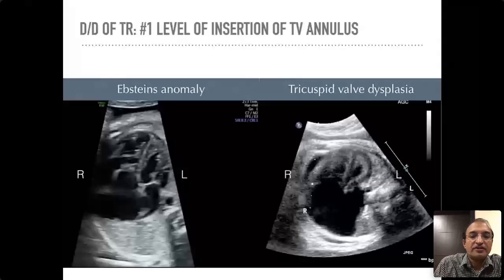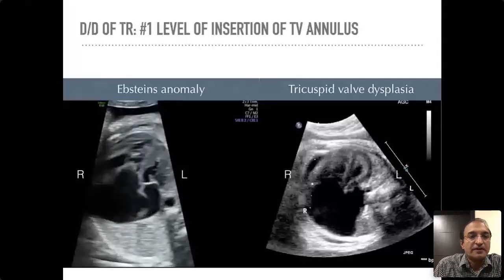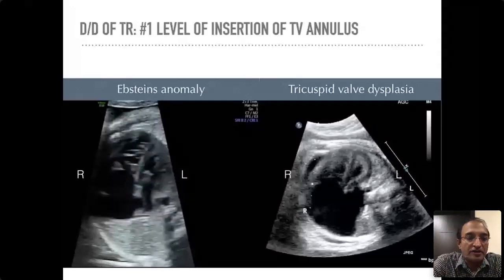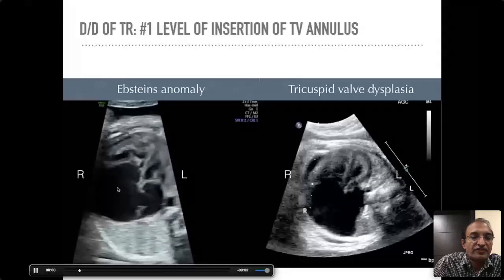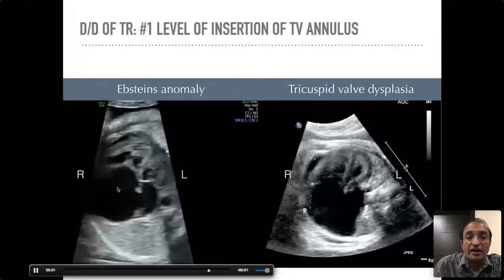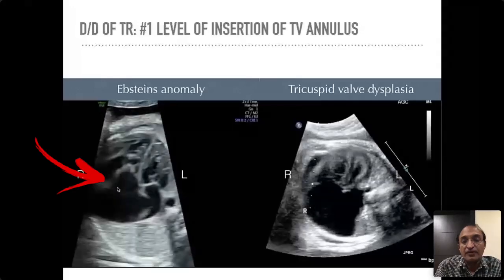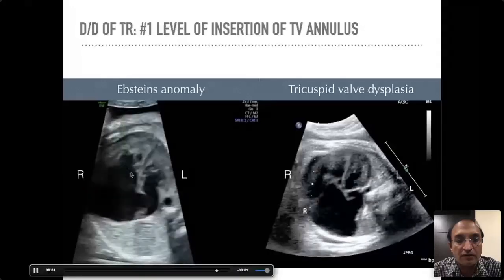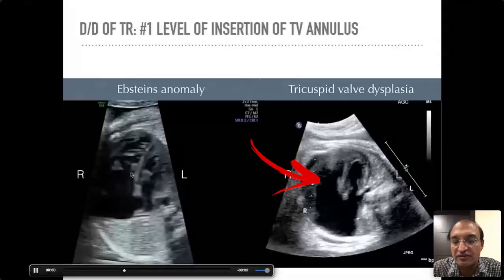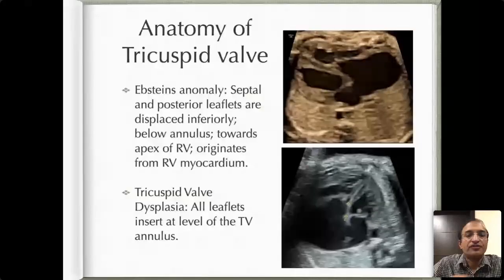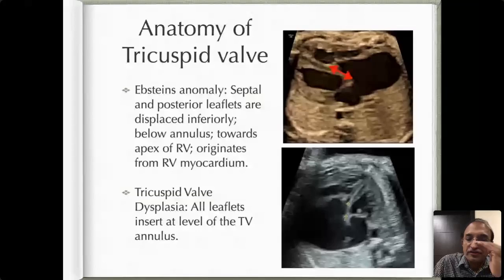Let's look at these pictures side by side. This movie is labeled as Ebstein's anomaly — note where the tricuspid valve is inserting. Right and left are marked so you can identify the right and left ventricles. In Ebstein's, the tricuspid valve inserts at a much lower level, displaced downwards. In tricuspid valve dysplasia, it stays at the normal insertion level. The hallmark of Ebstein's is downward displacement of the septal leaflet, whereas in dysplasia all leaflets insert at the normal level.